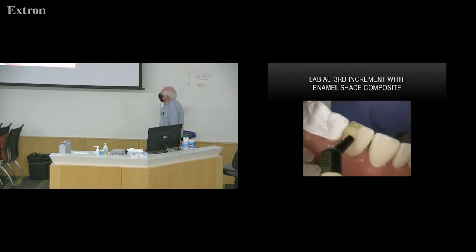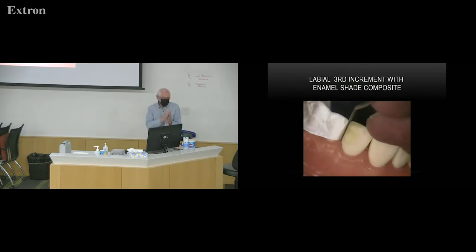So we put that on, and then use your gloved finger. Push it in, compress it, shape it. Do you see where we're getting our contact now? Because you're pushing it right up against the Teflon tape like you did with class three.